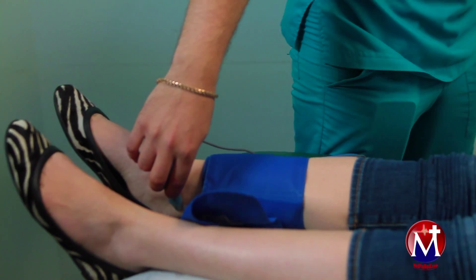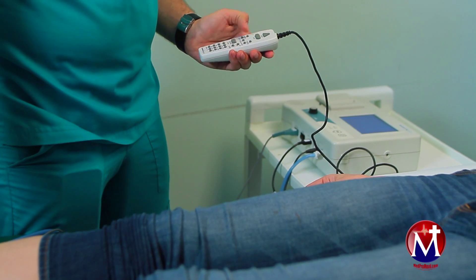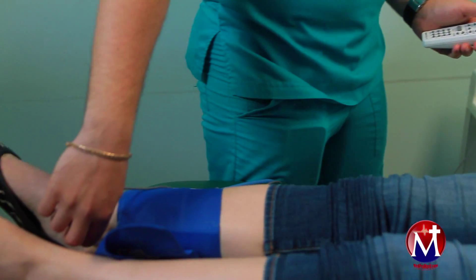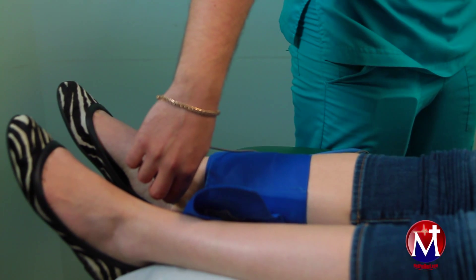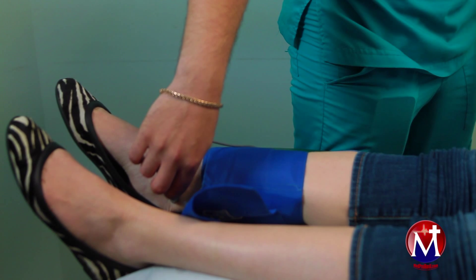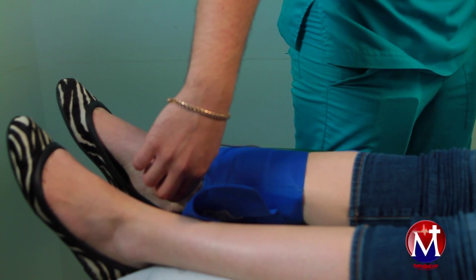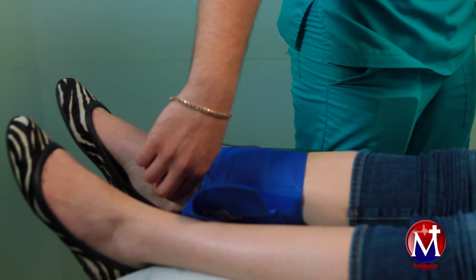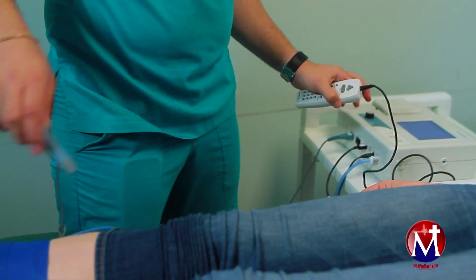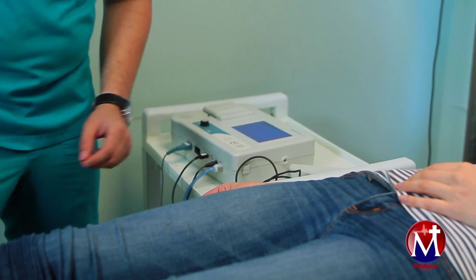Our service from MedPro accurately performs this test and enables your practice to treat the patient in the most efficacious manner. There is no patient preparation needed. The test is simple, painless, and non-invasive and can be done almost anywhere. This test offers valuable information in assessing patients for peripheral vascular disease and cardiovascular risk.